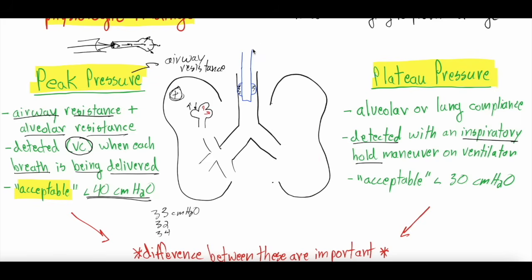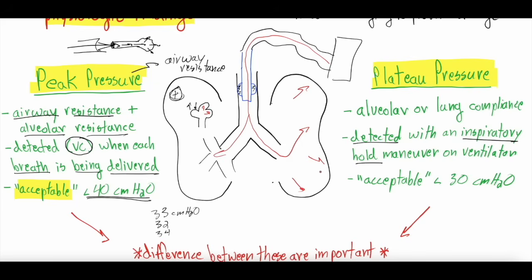I'm going to redraw, right? The endotracheal tube comes out the mouth. There's this tubing, and it goes onto the ventilator. And again, this is a closed circuit. The idea that it's a closed circuit is really important. So when we deliver a breath in, as we said, the breath travels through the tubing, through the endotracheal tube, through the trachea, the bronchi, into the bronchioles, and then it inflates the lungs, right? It goes to both sides, obviously.